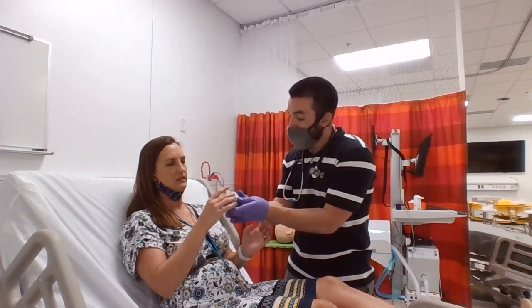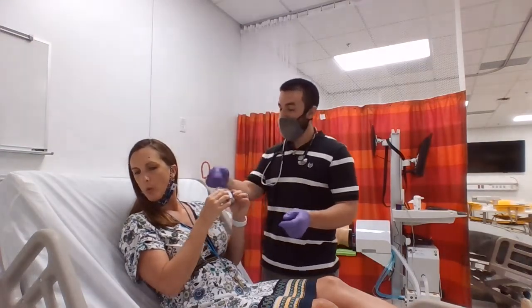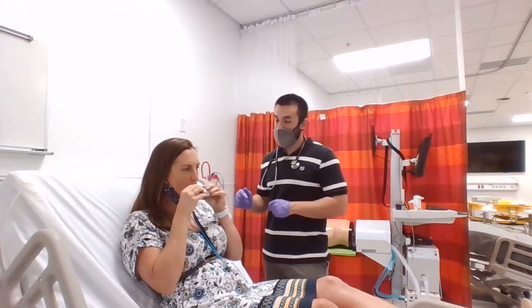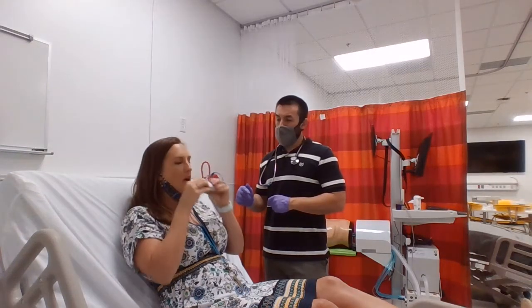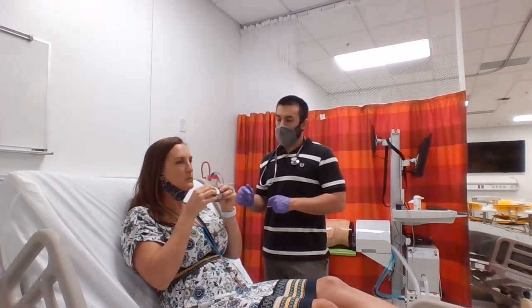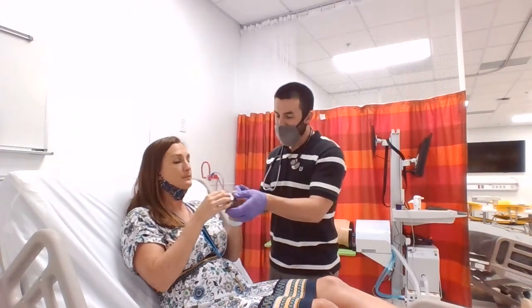All right. Now we're 58. So blow off to the side. All right. Seal your lips around that mouthpiece. Nice big fast deep breath in. And hold. I didn't taste it. Was I supposed to taste something? Let me take a look here.